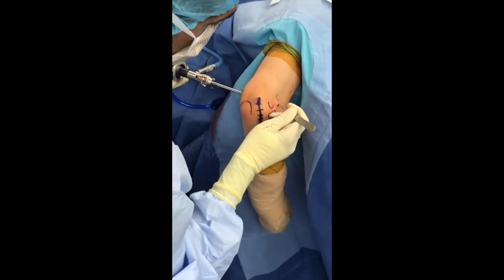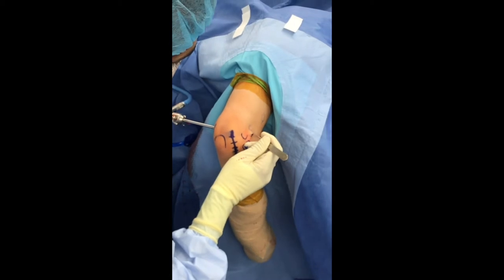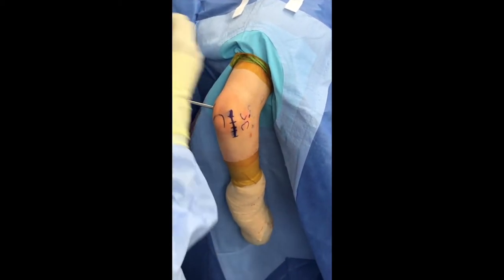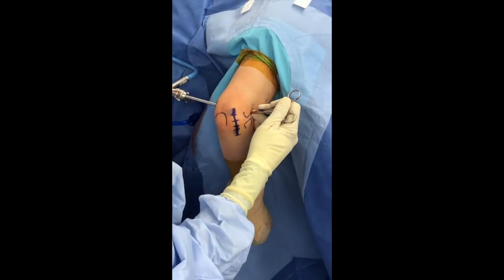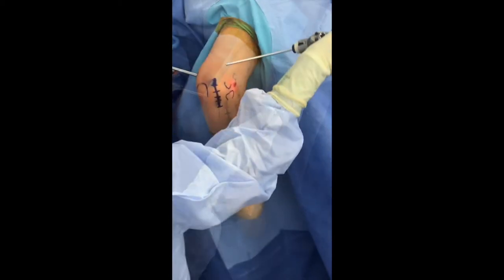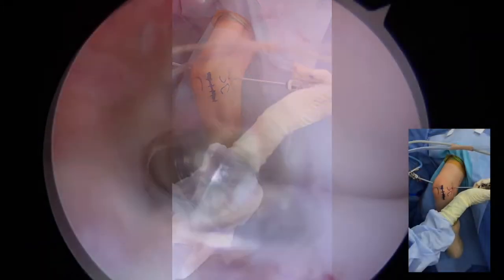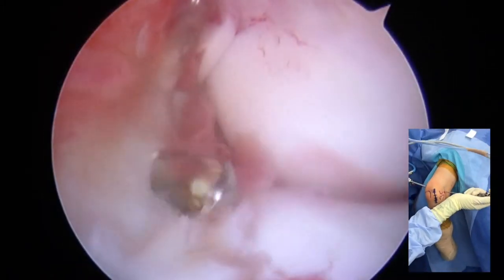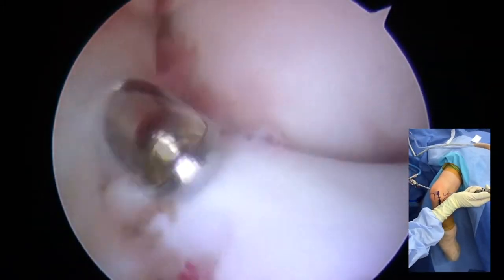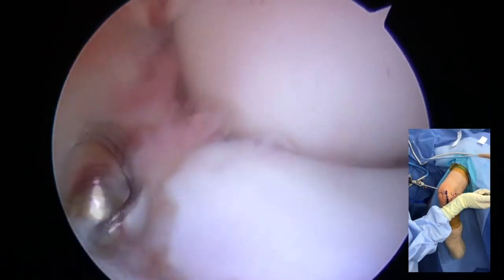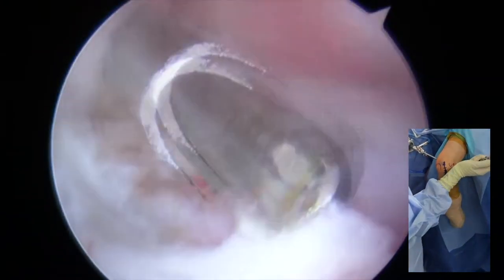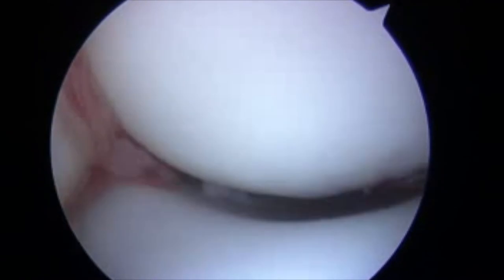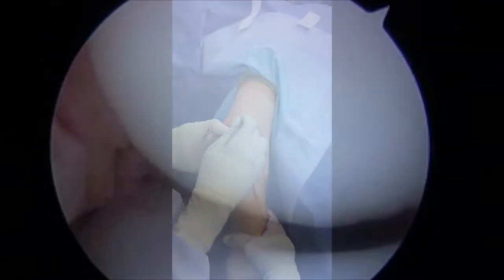Standard anterior compartment arthroscopy is performed with a proximal anterior medial portal for visualization, and a lateral portal is created in a standard fashion. A synovectomy is performed, and then diagnostic arthroscopy in the anterior compartment is performed, especially looking for loose bodies.